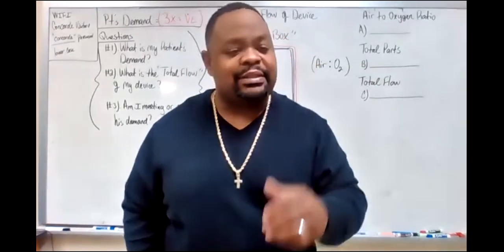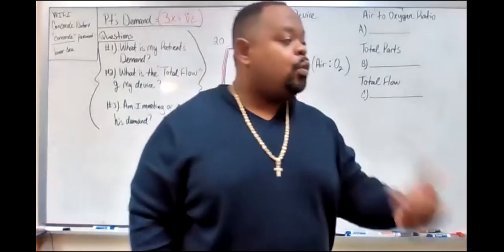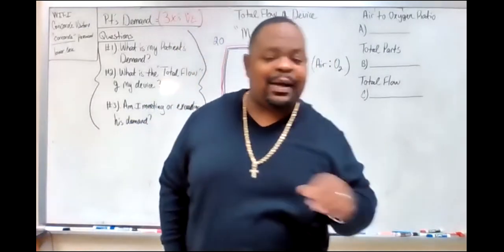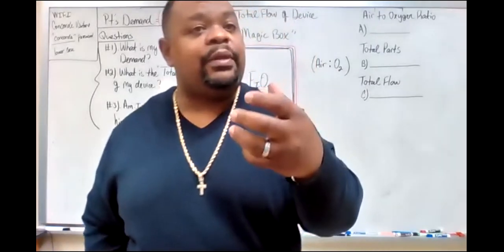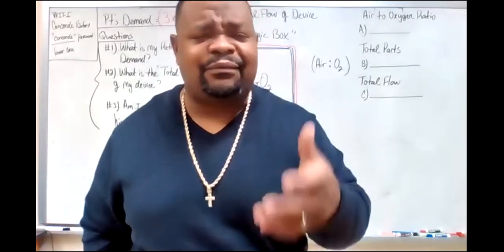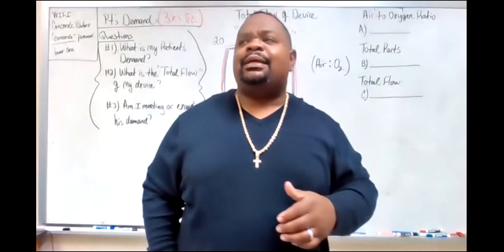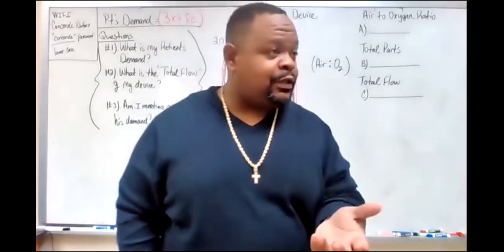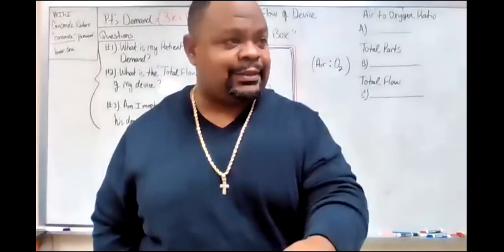So now, once we look through all of that, we decide we're going to give some oxygen, okay? Whatever the reason, this guy or this lady needs oxygen. So now I have to decide what device to put them on in order to beat the hypoxemia. And we learned that if it's a low flow device, they need to be breathing consistent and regular, right? Respiratory rate around 25 or less. Now, if you see 26, that's okay, right? But that still qualifies. And tidal volumes around 300 to 700. Okay, they qualify for a low flow system.